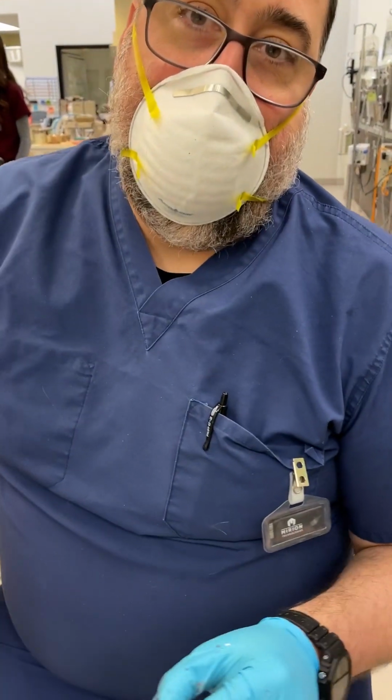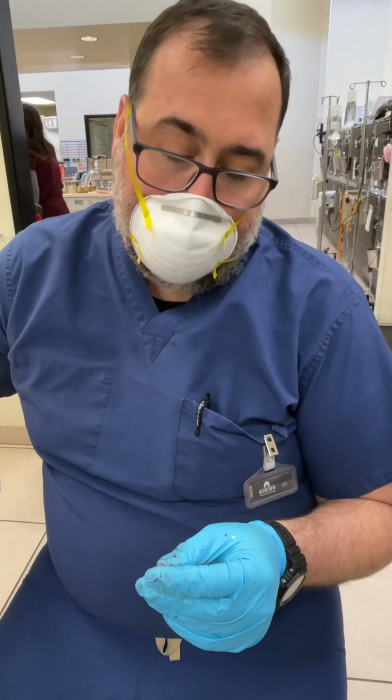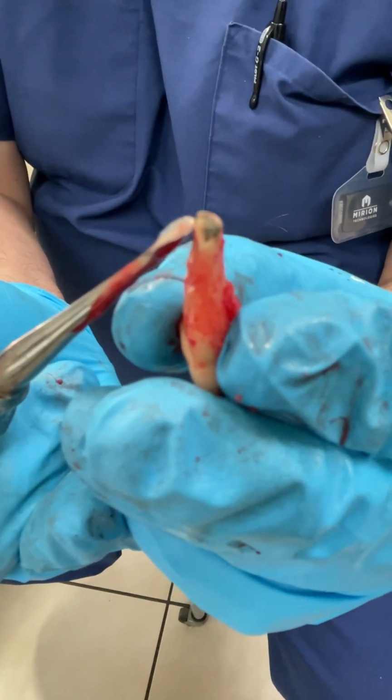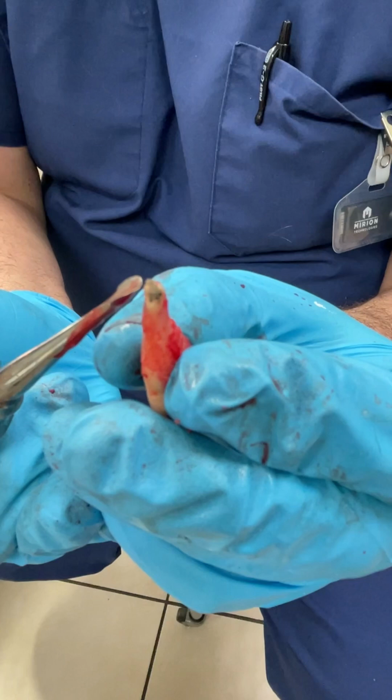So we just removed that tooth that was abscessed, and you can see just the amount of disease on this root. This is one of the 3 roots of that tooth. But I'm gonna point it out. You can see this is the tip of the root. All that black is just dead and infection. So that was actually up into the mouth and where the bottom of the root was.